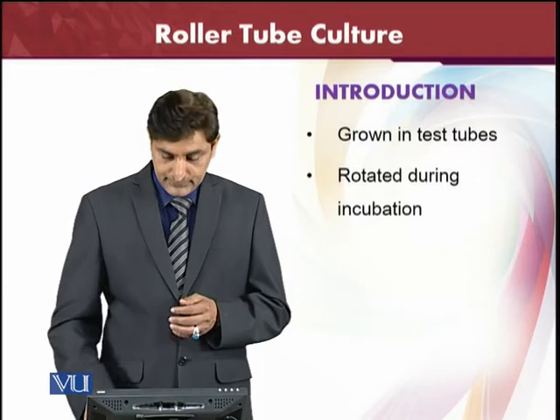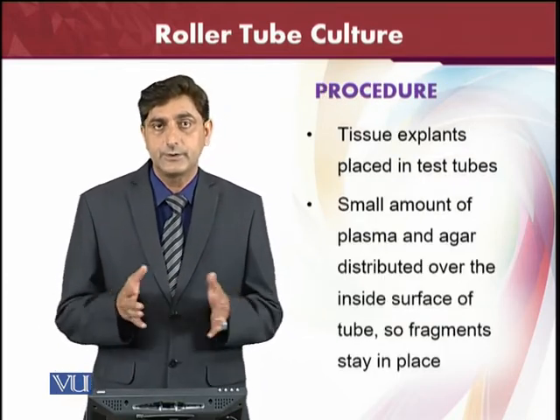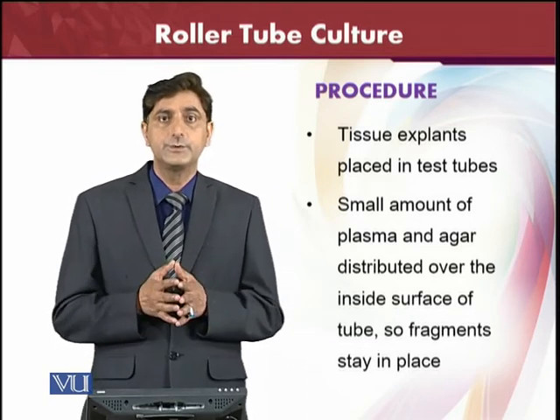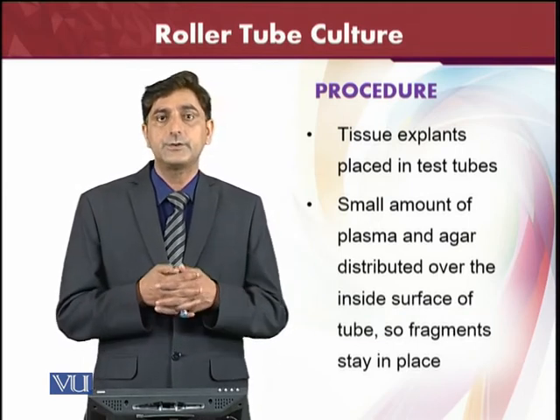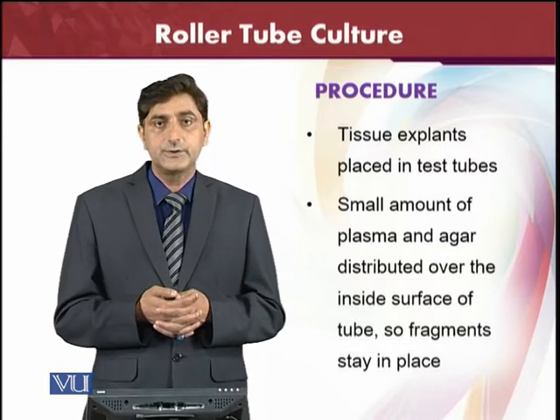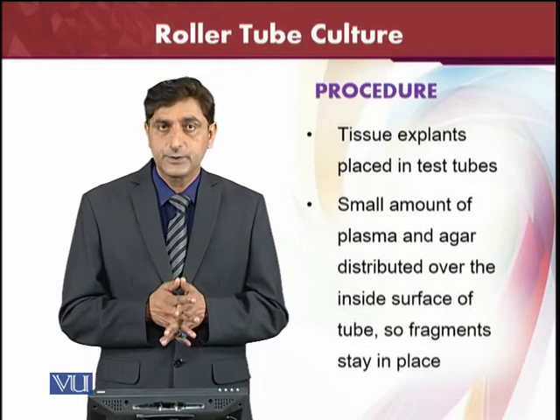this culturing. We will see the procedure, and then we will see the different kinds of roller tube cultures, why we use them and how we use them in different kinds of methods which are used in molecular biology or methods which are used in virology. Tissue explants placed in the test tube. Of course, we already see that the roller tube cultures are used for the tissue explants.